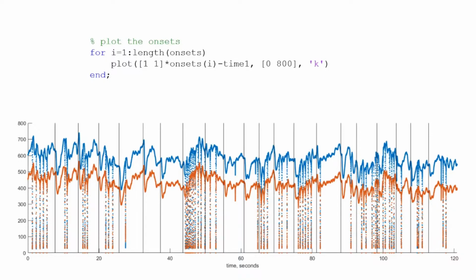And then we will have a data matrix of, let's say, 20 rows corresponding to the onsets, corresponding to the stimuli, and a large number of columns. If we take 10 seconds before and 10 after, it will be 20,000 samples.